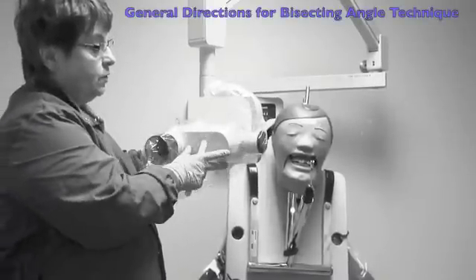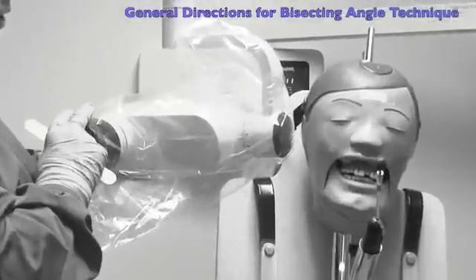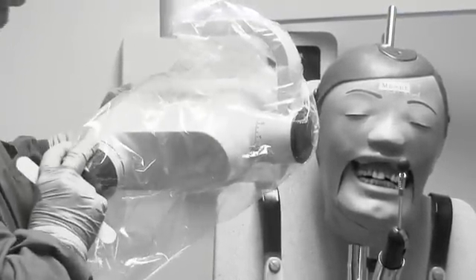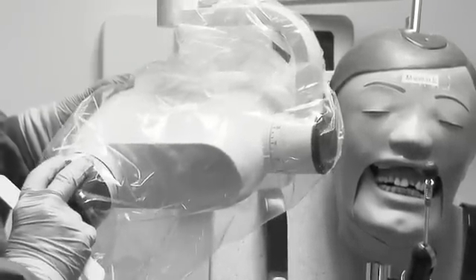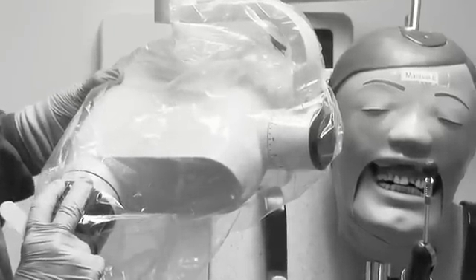When doing bisecting angle using the snap array, we're going to set the angles according to where we are in the mouth. On the maxillary, we're going to set it for a positive 20 to 25. When we get to the premolar, it would be plus 30, then 45 for the canine, and 40 or 45 for the centrals.